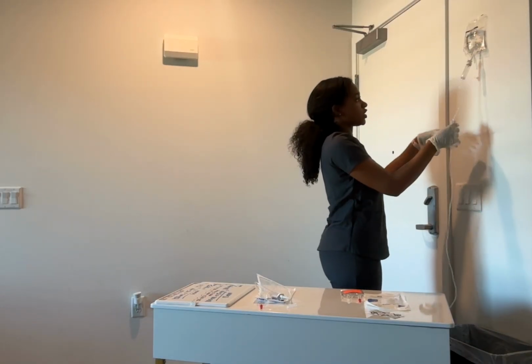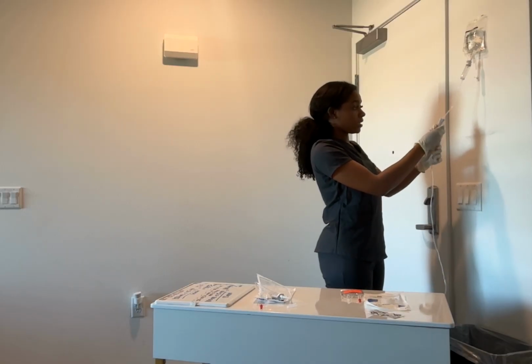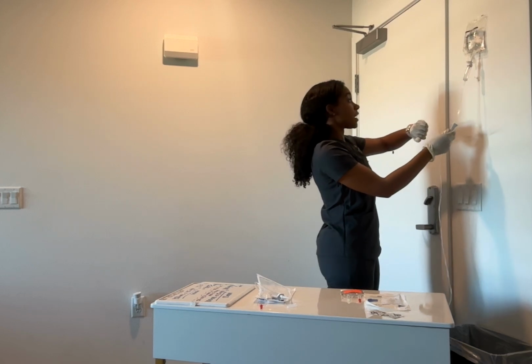And I'm going to make sure it is adjusted for 38 drops per minute. I'm going to do this. Perfect. By timing for a minute, and I'm going to start timing now.